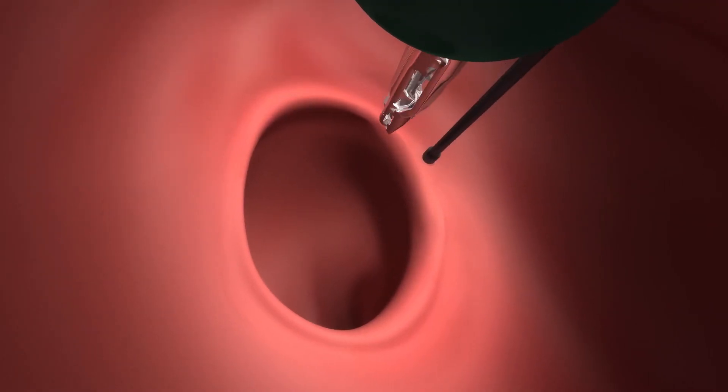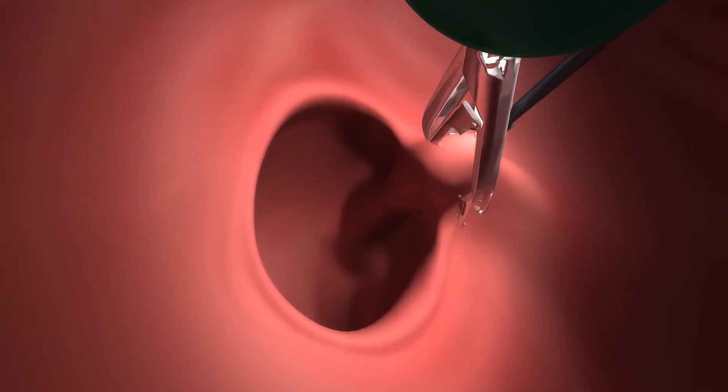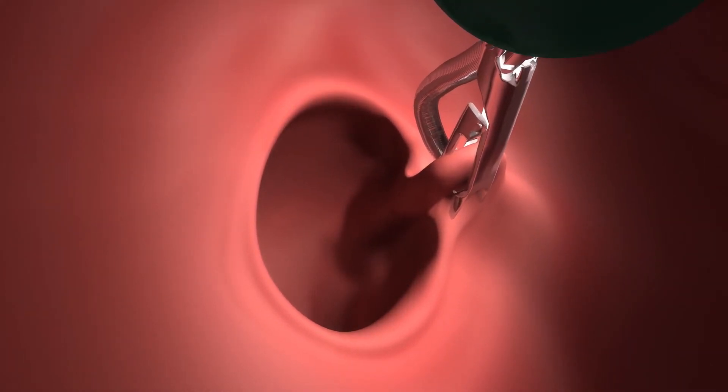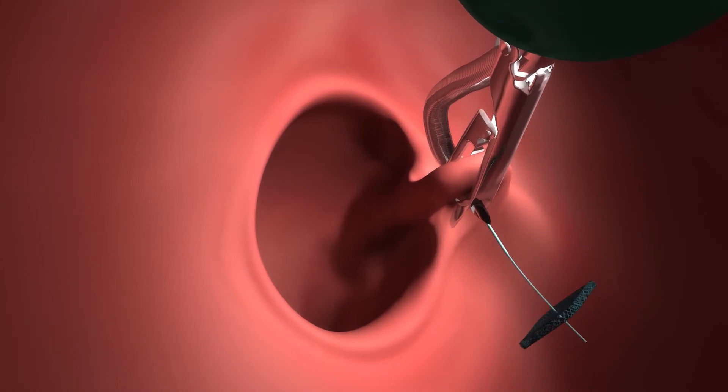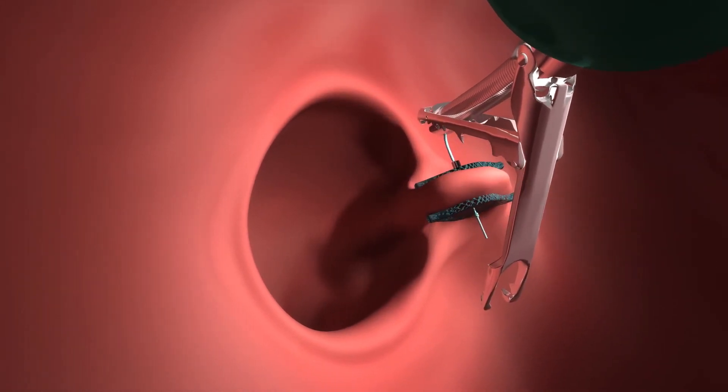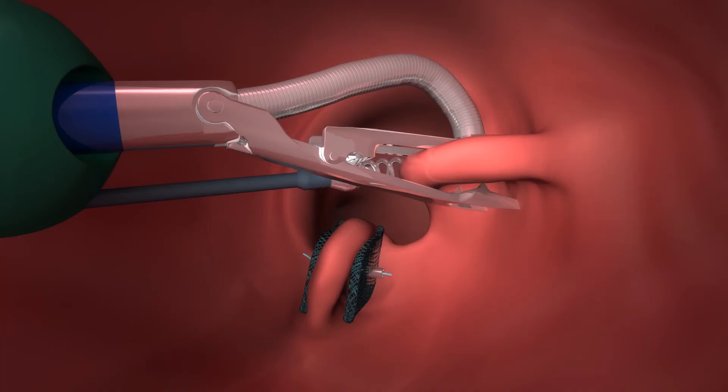Specialized instruments are then used to create gastric folds. Under direct vision, a needle is passed through the tissue and a pair of expandable tissue anchors are placed to secure the fold.